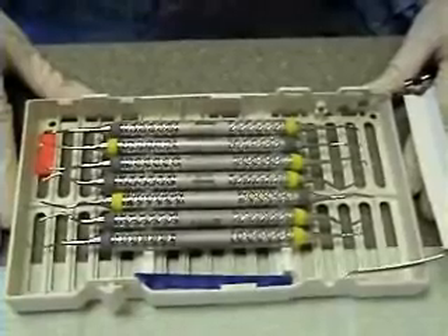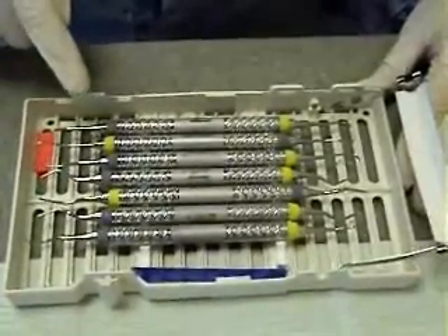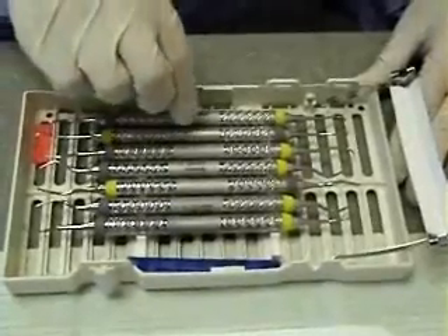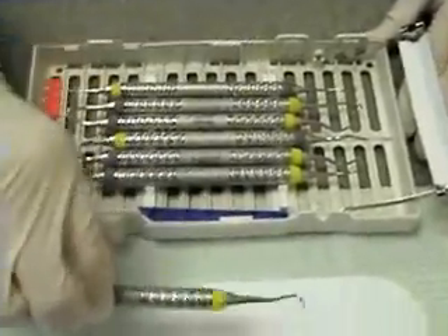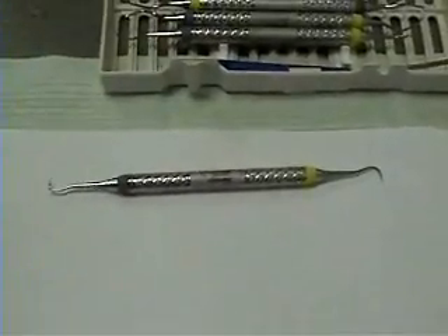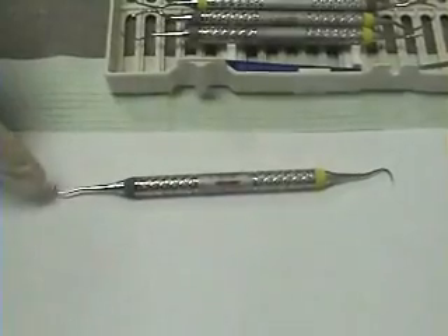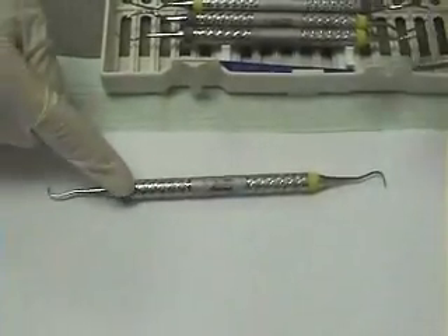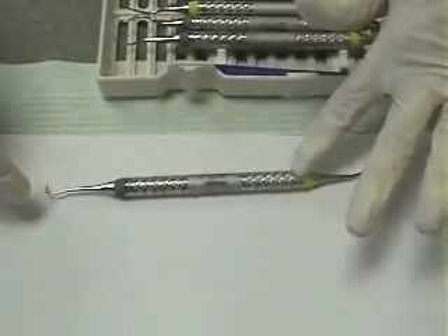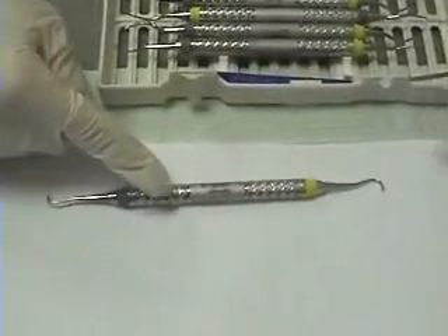We're going to briefly go through the instruments in your kit one by one. These instruments are either area-specific or universal. The first instrument is the anterior sickle. Note that it has two sides and they are not mirrored — one end is slightly at a 90-degree angle and the other end has a curved working end.